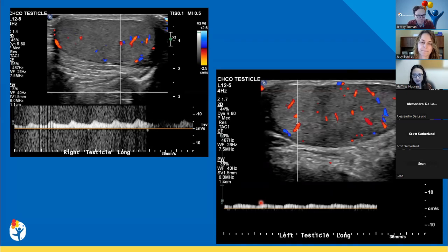It seems like the sonographer was able to only get the better waveform more peripherally on the left. And then on top of that is tardus parvus. So that just means that there is truly decrease on that side. Yeah, that's definitely a good observation about that. Get that one centrally, yeah. Right. Definitely a good point that it's easier oftentimes to get flow peripherally rather than centrally, especially in these kind of torsion cases.